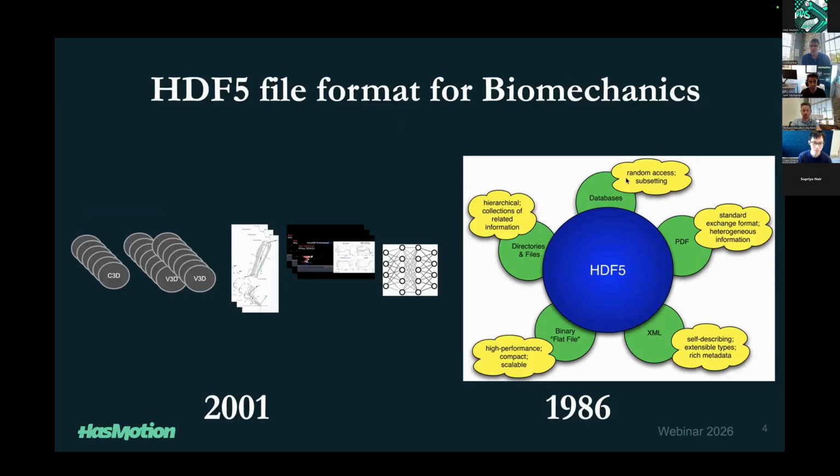Let's show you our first instance of it, which is simply replicating the data from our file format so that our software can open and save it just like it was our file format. This is where we're starting, and we'll let people tell us about it. And I think now I'm going to pass on to the programmers because this isn't scary. So let's let Clark and Amra talk about it.